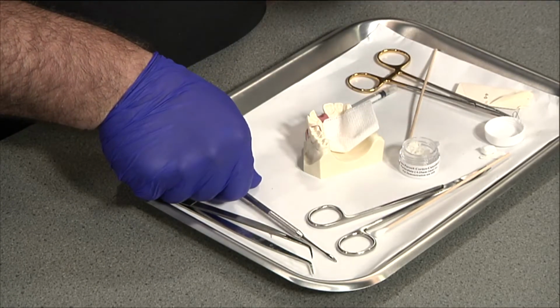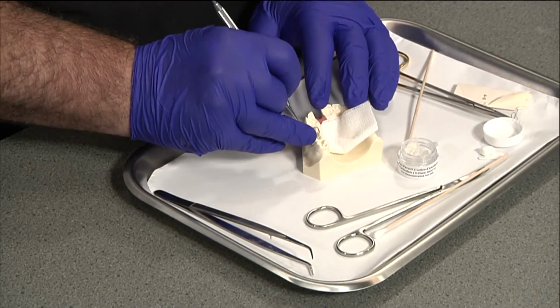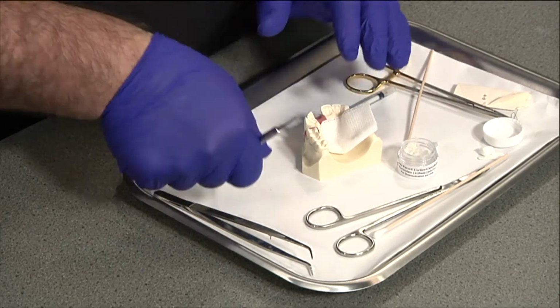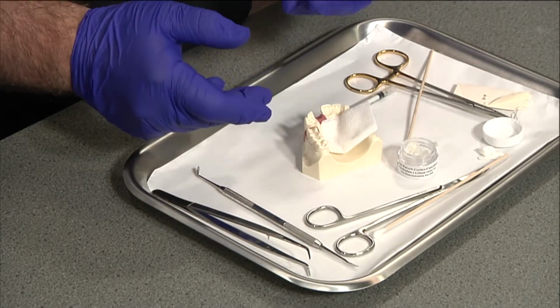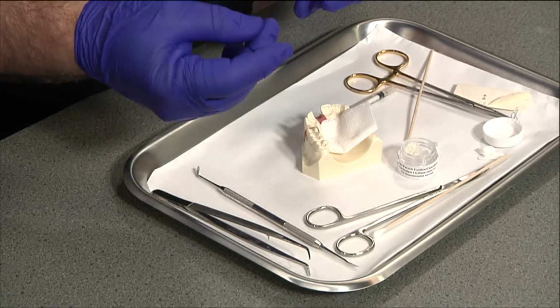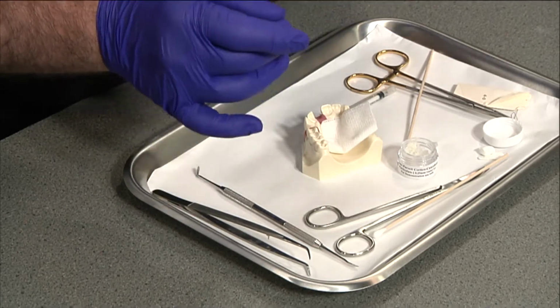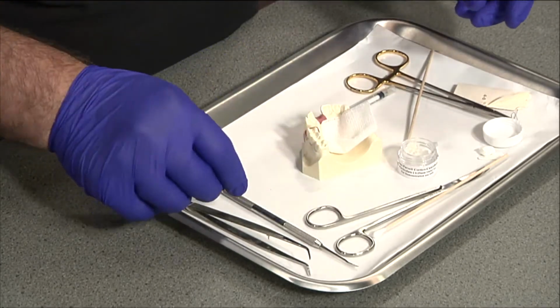I actually use the butt end of my dental mirror, which I don't have in this setup, as my condenser. People ask how much pressure to condense the bone, and even though I'm a surgeon, I remember how much pressure it takes to gently condense dental amalgam. I would say that's the pressure. Every dentist understands that amount of pressure, that feel.